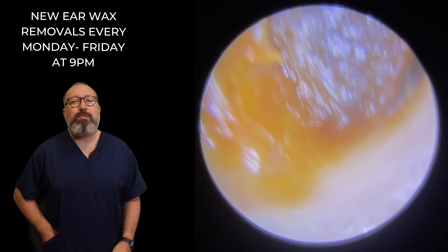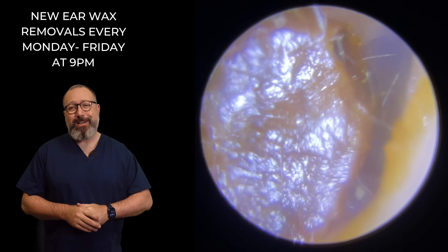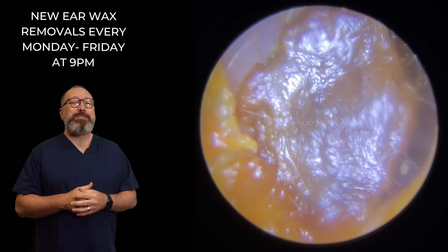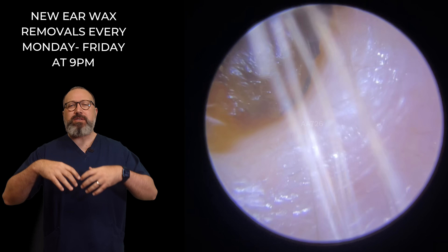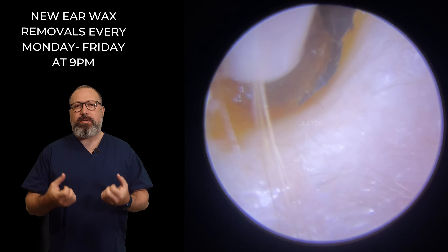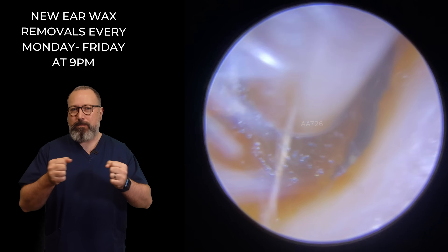Hi everybody, this is Rhys Barber from Audiology Associates. Thanks very much for watching this earwax removal compilation video today. We've got two patients in this compilation. The first patient has a quite hard, thicker plug sitting in the lateral portion of the ear canal.